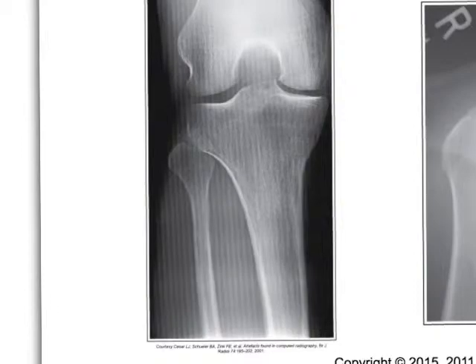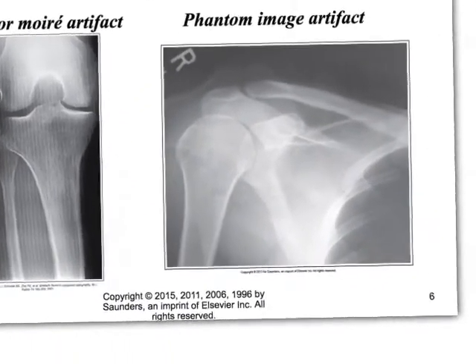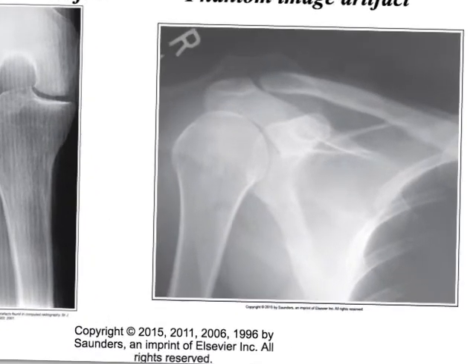Okay. Phantom image artifact. I can see two humeruses in this, right?